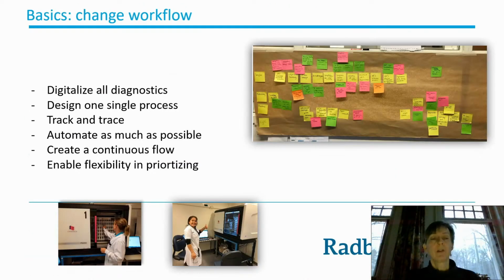So what do you need to change your workflow to a digital diagnostics environment? It took us really many sessions to go through all details of our work process to change the workflow, because we decided if we go digital, we must do everything. You can't keep up a digital flow next to the flow with glass slides.